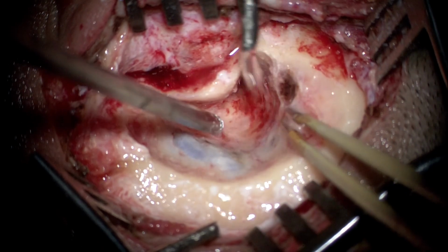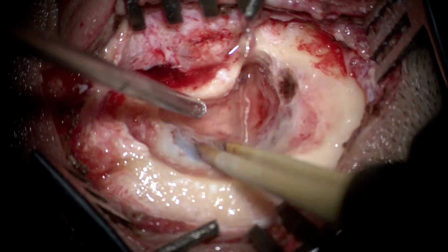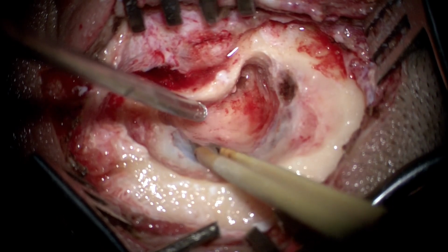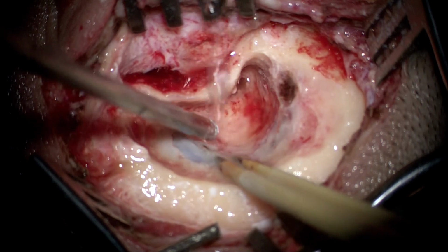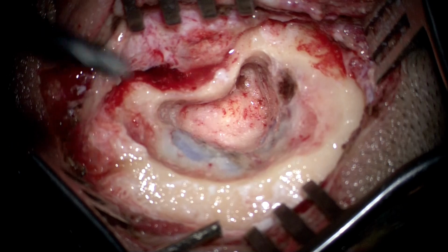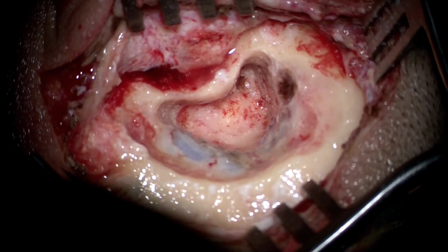Now this gentle bipolar coagulation under ample amount of irrigation using thin light strokes basically just tightens the dura, whether it is tegmen or posterior fossa dura, and thus brings about a fair amount of decompression. We can see how much excess exposure we have achieved through this step.